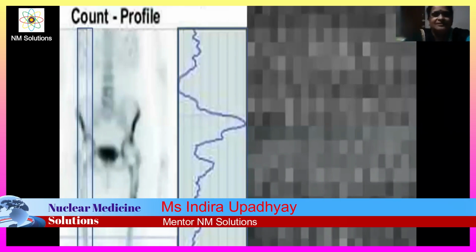Hello dear viewers, I'm going to start my presentation with this image. Now what is it all about? It is about showing you the count profile even on the nuclear medicine image.